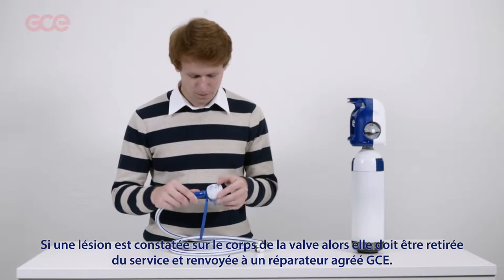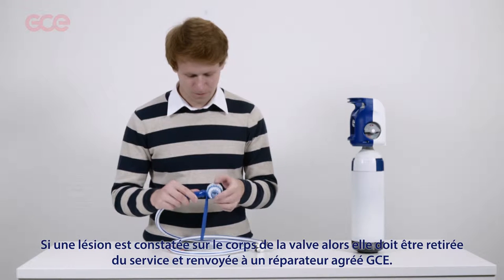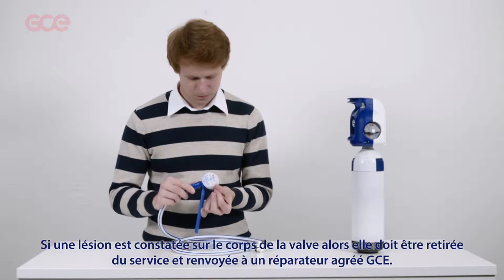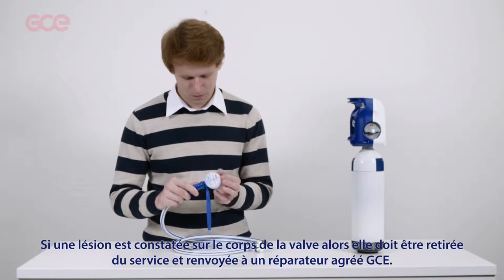If cracks or significant damage are evident on the valve body or on the rear cap, the demand valve should be withdrawn from service and returned to an approved GCE repairer.